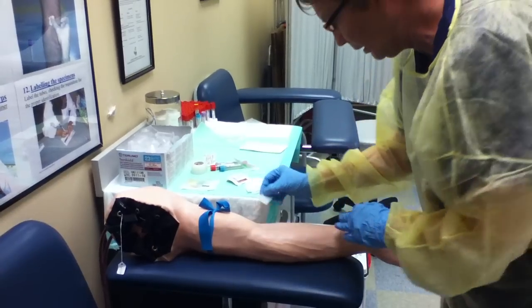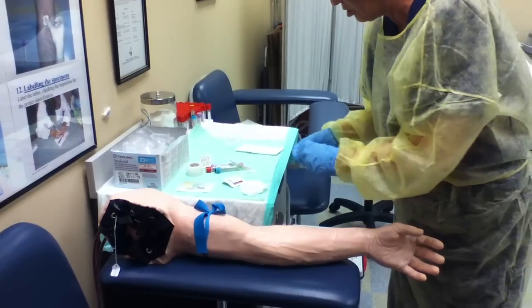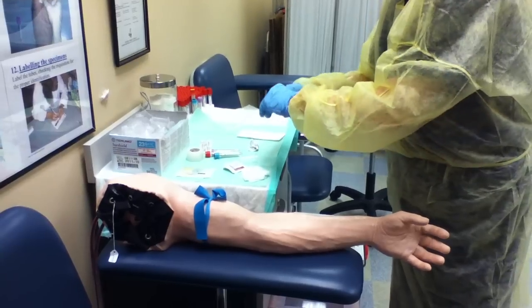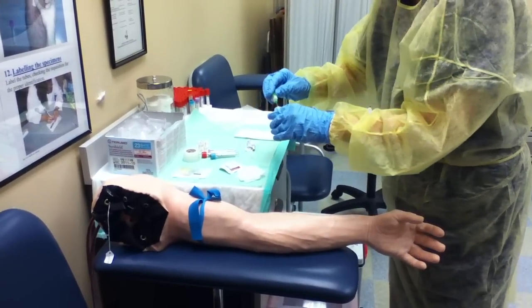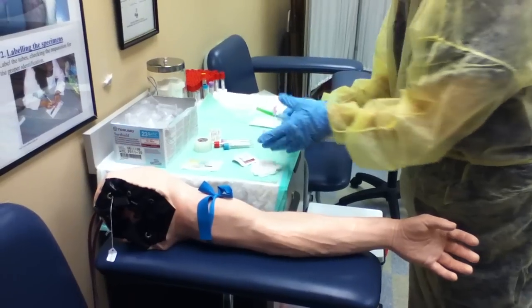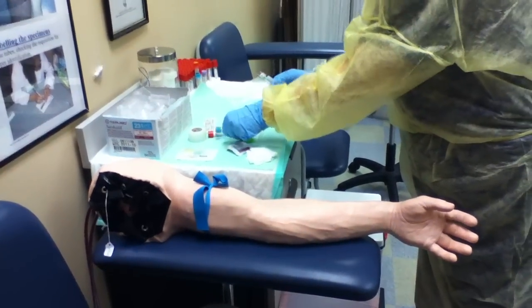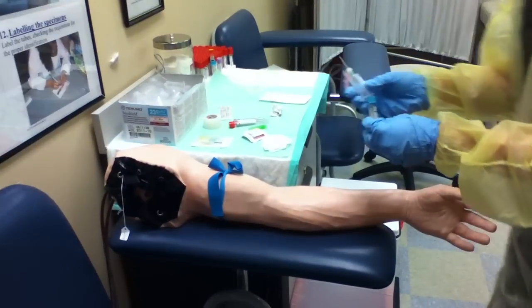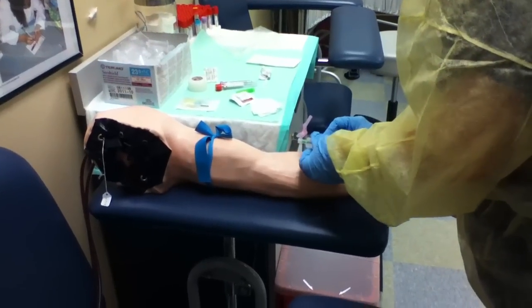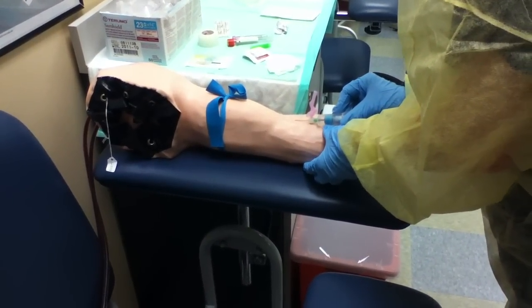You're going to wipe the site clean. On the mannequin the alcohol doesn't dry, but you should let the alcohol dry. You're going to take your needle and put it into a vacu-tainer. You're going to have all your supplies set up before you even start. You're going to take your first tube of blood and slide it into your vacu-tainer. You're going to insert the needle with the bevel up into the vein.